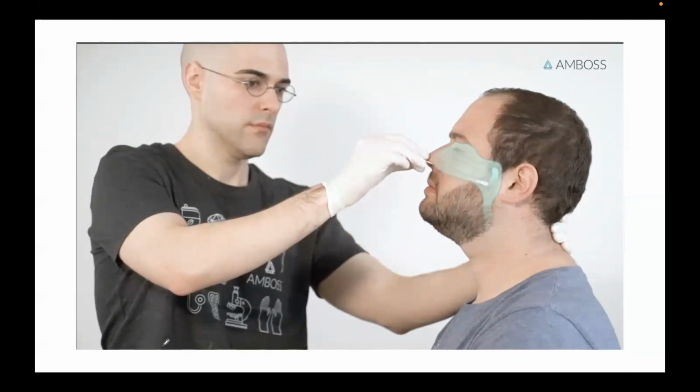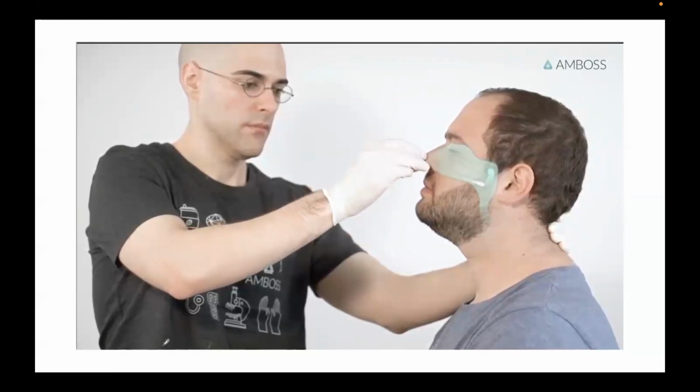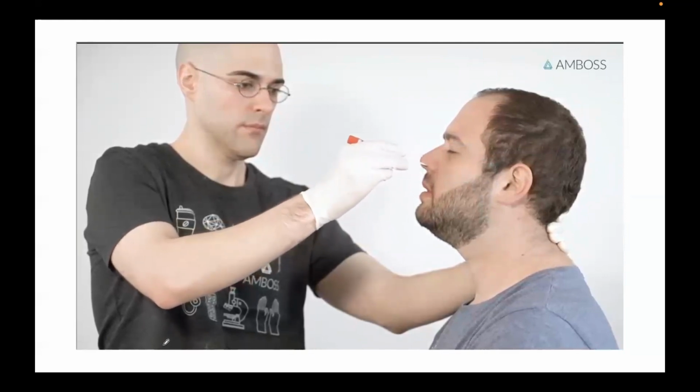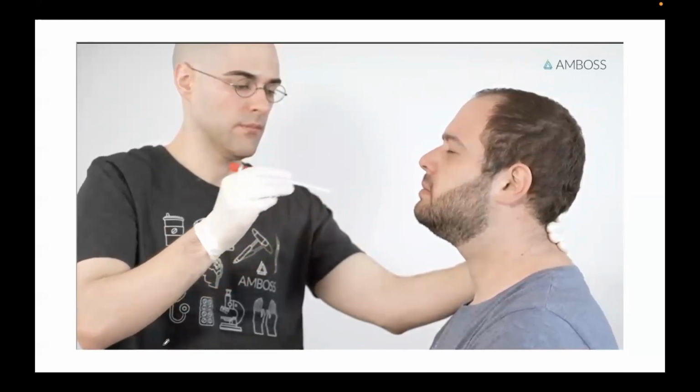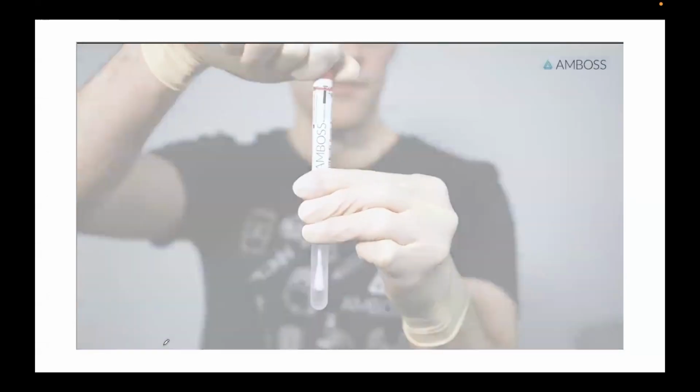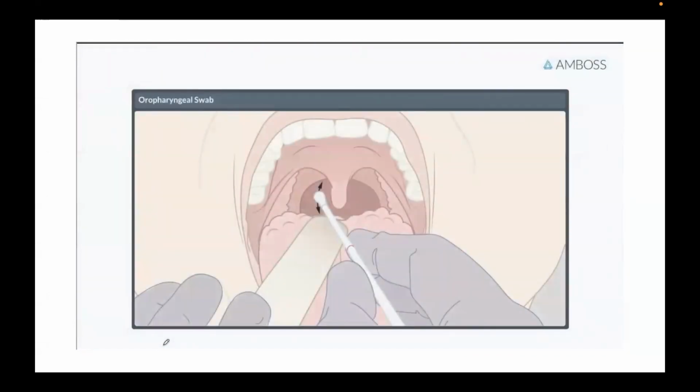Ayan. Leave the swab for a few seconds while gently rotating it by twisting the swab shaft. Tapos i-rotate mo siya 5 to 7 times, rocking the wall. Mga 10 rotations. Slowly and gently remove the swab. Ayan. Tapos rotate mo din siya habang nire-remove. Immediately insert the swab into the sample collection tube, okay, lagay mo agad dun sa tube which contain yung 2 to 3 milliliters of viral transport media, VTM, pataob.